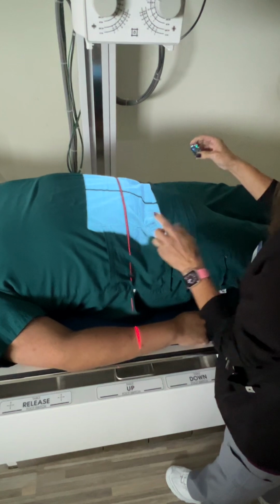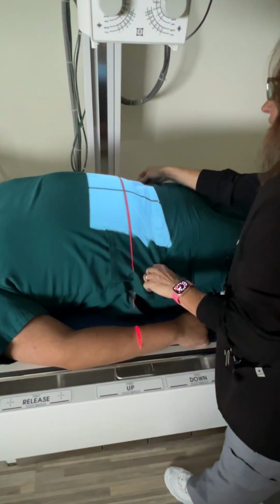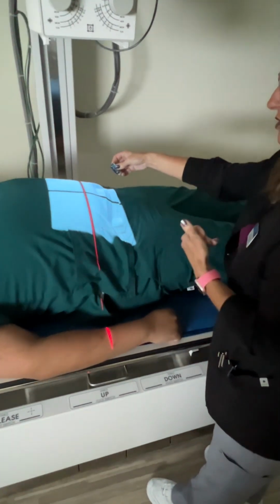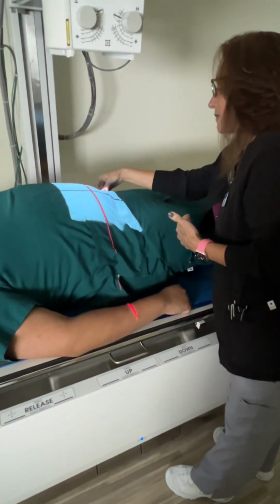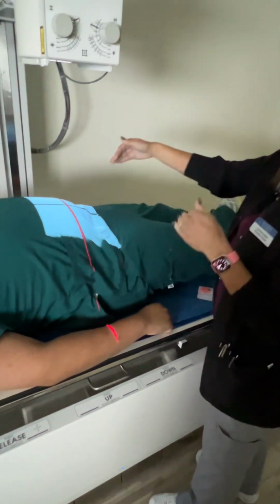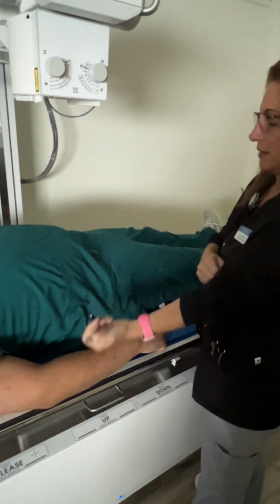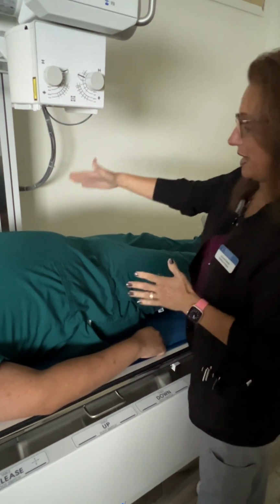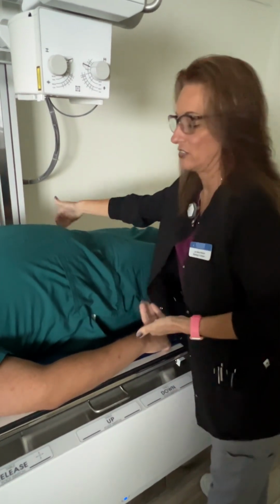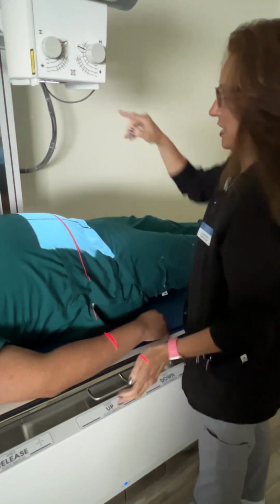This is left marker. It's gonna go on the patient's left side. And a lot of times in the field, I've been told they don't stick the markers on the patient because you lose your marker. Apparently they're putting that under the patient. Honestly, I just feel like I'm in the habit of getting my marker, so I'm gonna leave it on the patient versus trying to shove it under the patient. If you can access the IR, that would be another option.